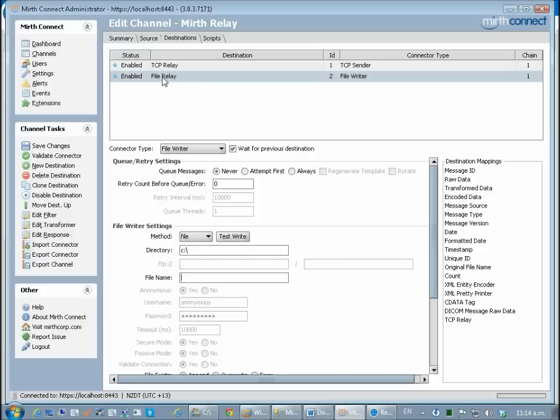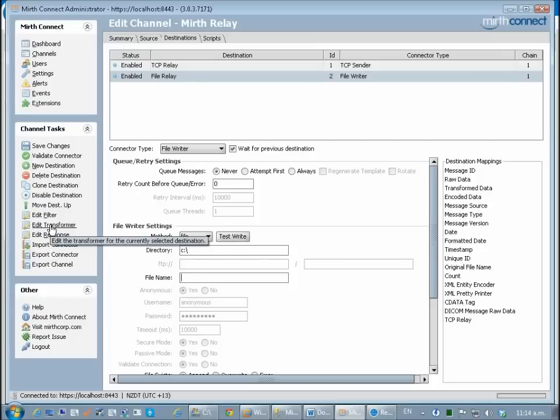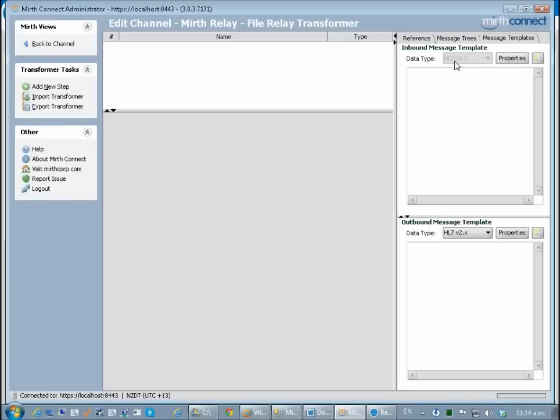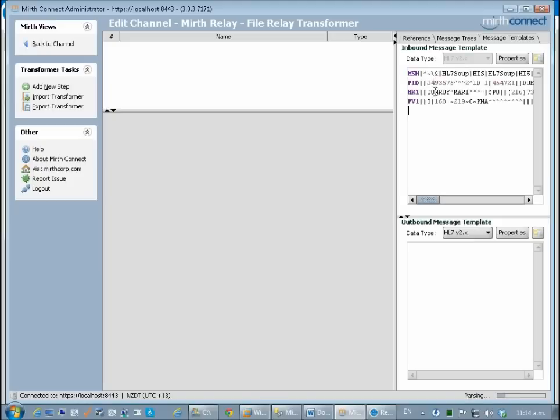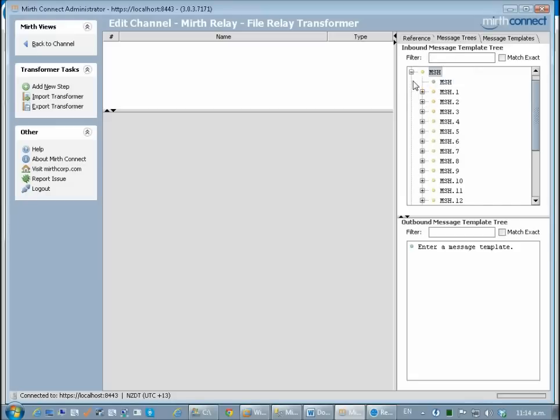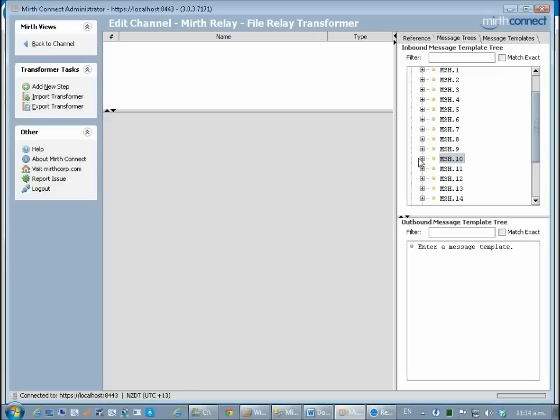Having selected file relay I now go to edit transformer and up to message templates. This is an HL7 message so I can paste that in and we can use this as our sample message tree. If I now go to the message tree I can go up to the MSH and I can scroll down to the MSH 10 which is the message control ID.